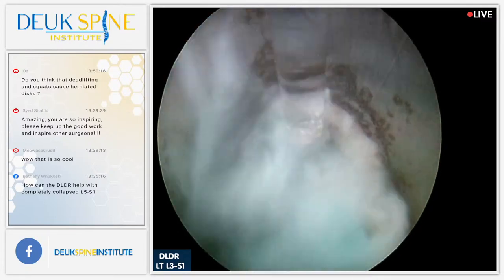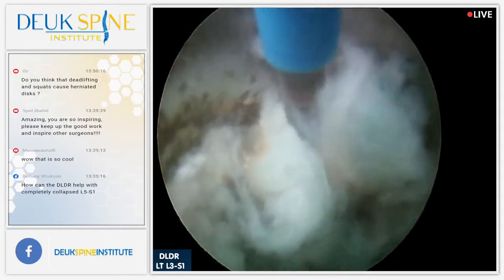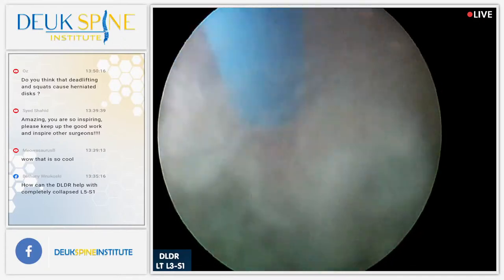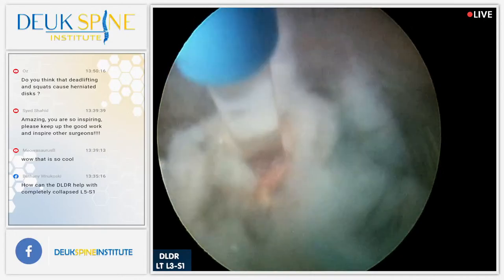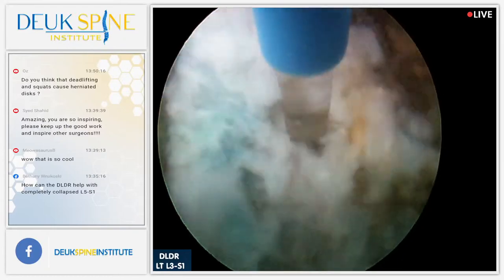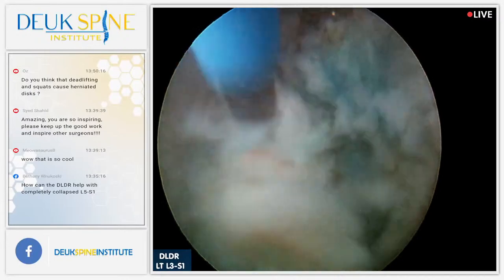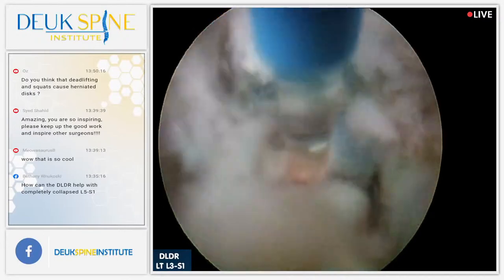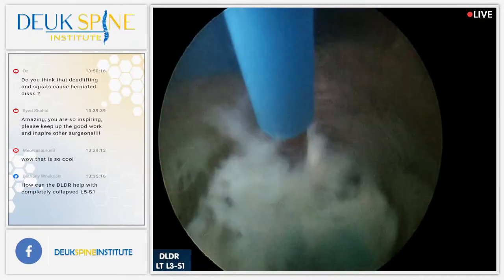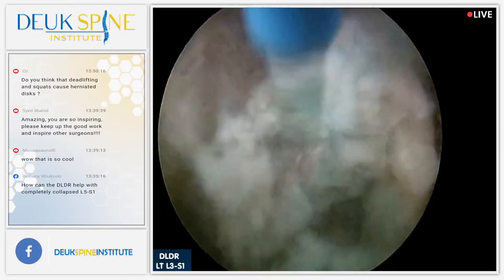One of the things that's nice about this particular patient is that we have really nice pictures of the anatomy, the normal anatomy. He doesn't have a lot of fat around his nerve roots in the foramen, so you're able to actually see the dorsal root ganglion. It's that white thing bulging out, and it lives in the neural foramen. And it's the cell bodies of all the axons, all the neurons, that make up the sensory nerve going down the leg. So all the skin in your leg that you can feel people touching your leg.